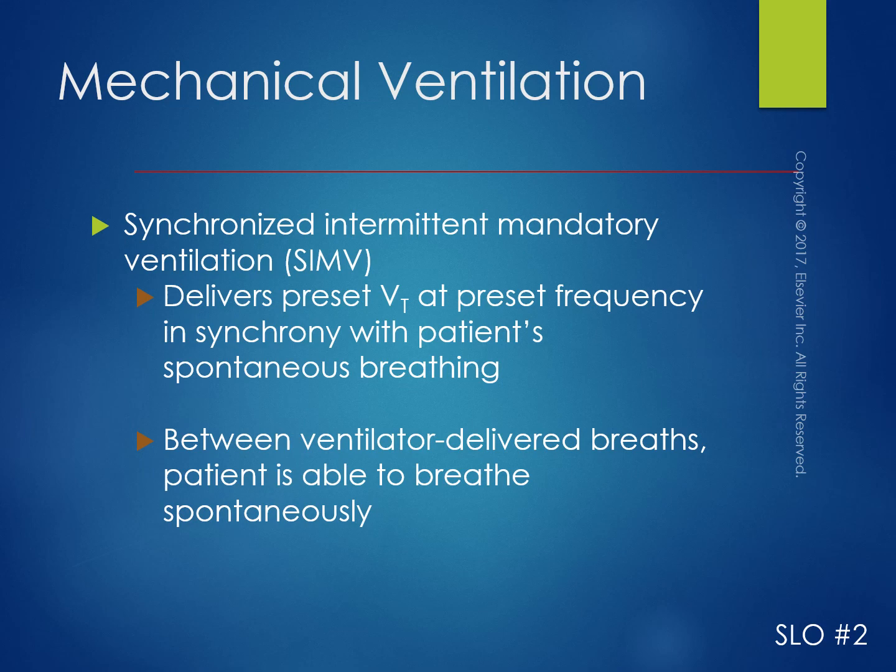This is also used really commonly for patients that are maybe slightly more stable. With this, it allows them to breathe with the ventilator and do their own work of breathing a little bit more than ACV.